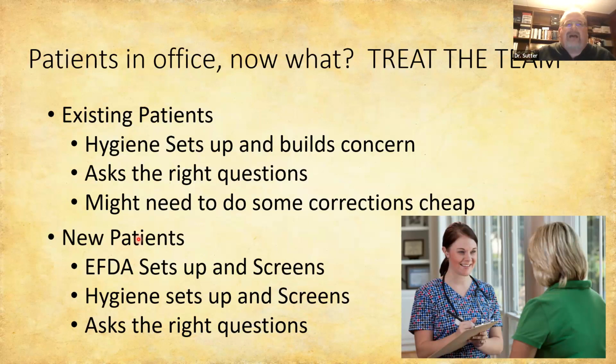And so I actually do have a T-scan in every op, but for years I practiced with one hygienist. She had her own handle, and then I had my own handle that bounced from room to room. So new patients, I don't want new patients to wait. And when I want information, I don't want to wait on the hygienist to get my answer, right?